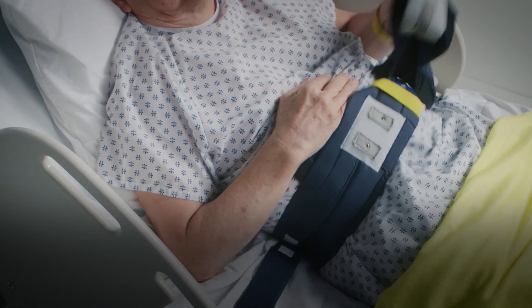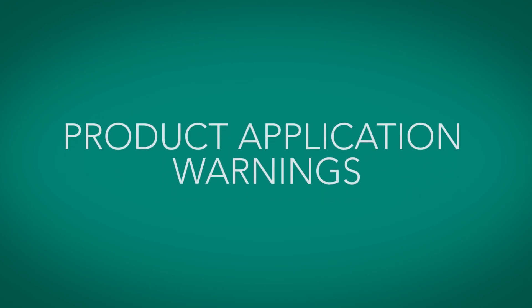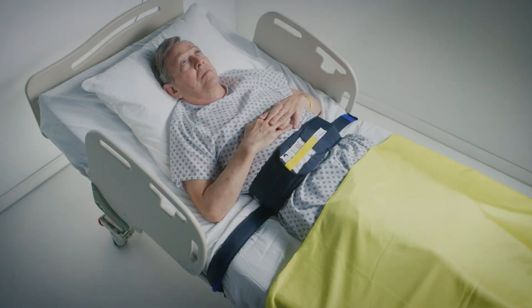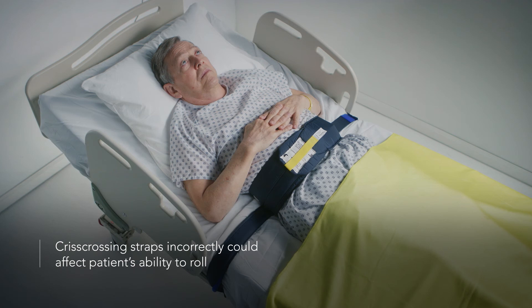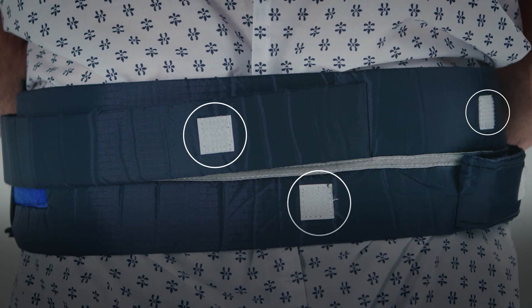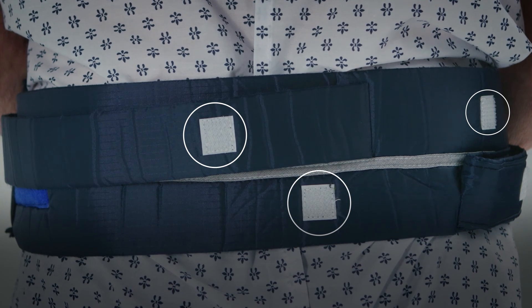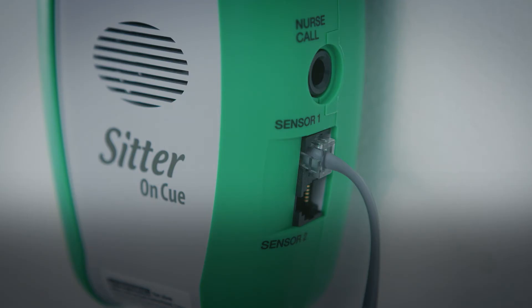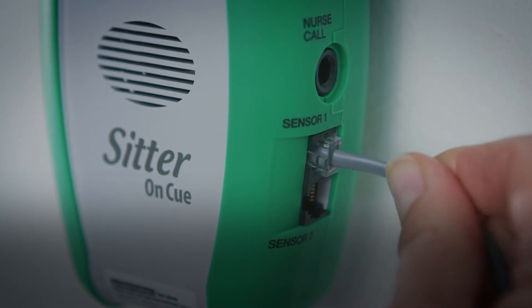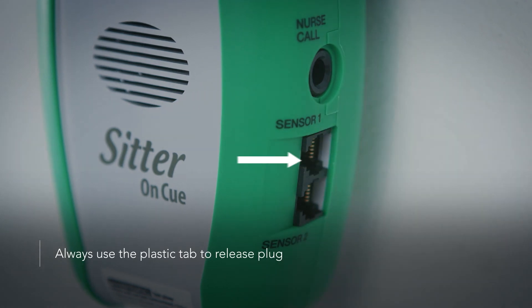Note: patients can self-release from the sensor in several different ways. There are a few important notes to keep in mind when using the Head Start Bed Sensor. If the narrow straps on the back of the belt are not properly crisscrossed upon application, the patient's ability to roll may be affected. If you can see the small white velcro squares on the back of the belt, that means it has been applied incorrectly. Never jerk or pull on the cord to remove the plug from the alarm, as doing so may damage the cord or plug and may cause the sensor to fail. Instead, always use the plastic tab to release the plug.